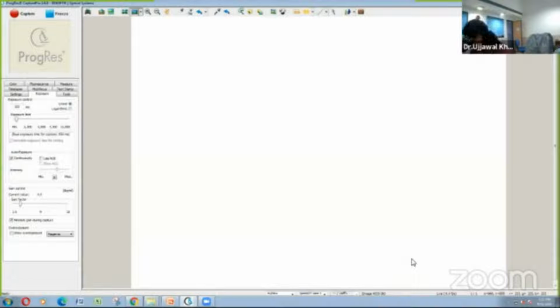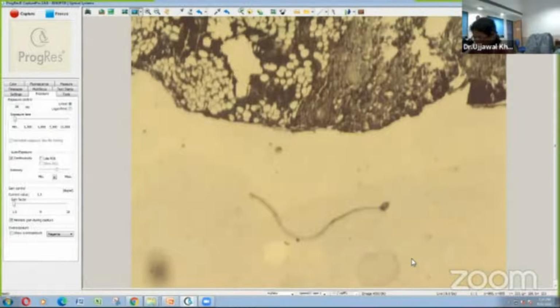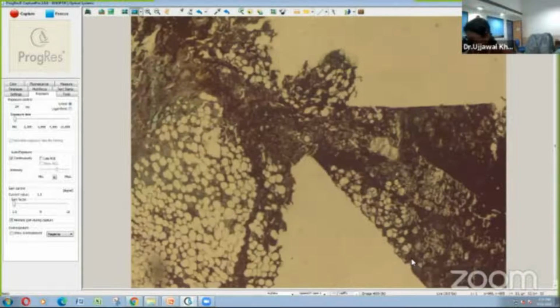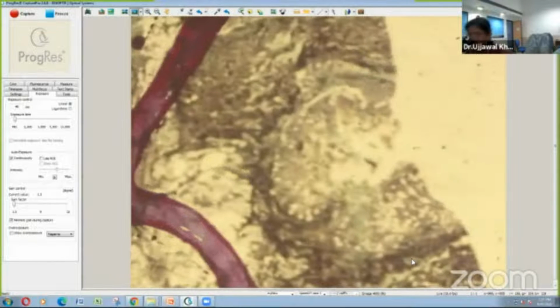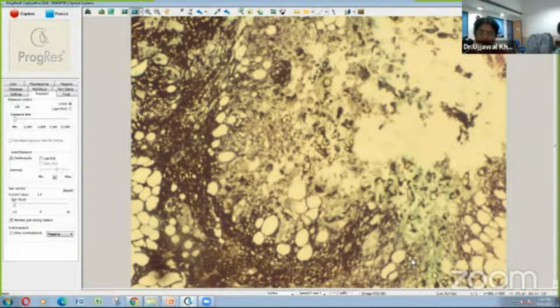So next, I go to the next case. This is a 51-year-old female with headache, pain, and swelling over the right side of the face, and we had a very important history that this patient was a post-COVID patient. GMS has worked wonderfully with fungi to highlight fungal colony formation. These are not just collagen; they have internal fungal organism structures, highlighting that these are indeed fungal organisms.